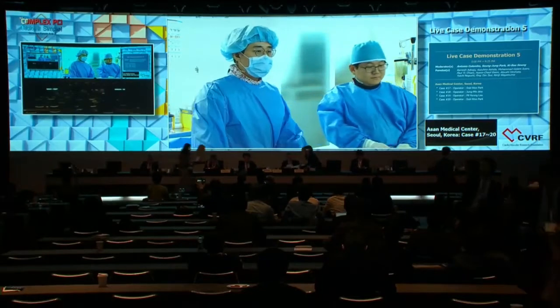Okay, would you introduce your case? Okay, Dr. Lee, could you introduce? Yeah. Let's see the case.